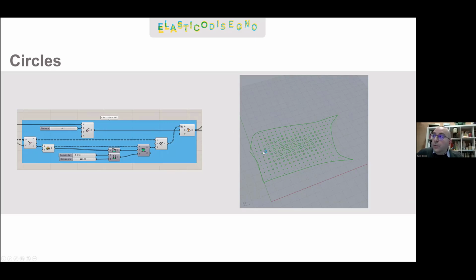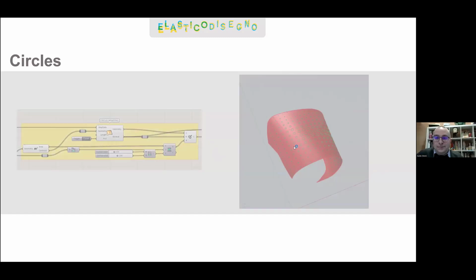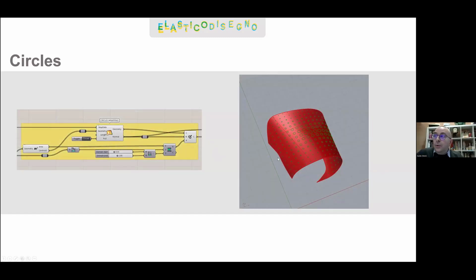There is an offset which defines a margin between the points and the shape, so that these circles don't overlap with the shape, exceeding the size that we defined. And here we have a start and end domain which define the minimum and maximum size of these circles. The circles are also defined so that they go from the smaller size closer to the edge to the biggest size further away from the edge. Using Shape Map again, we applied the unwrap back onto the surface.